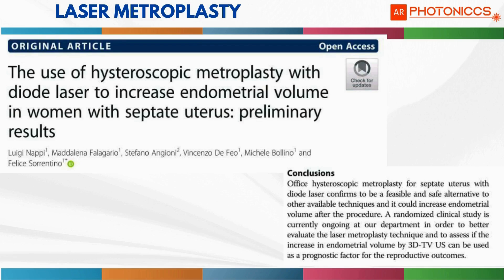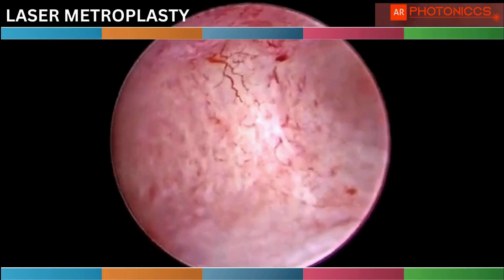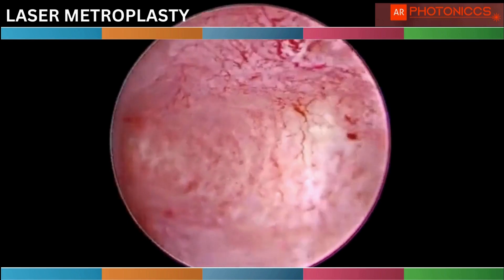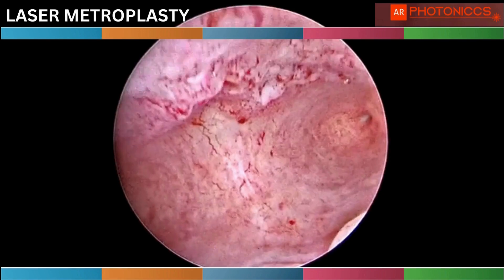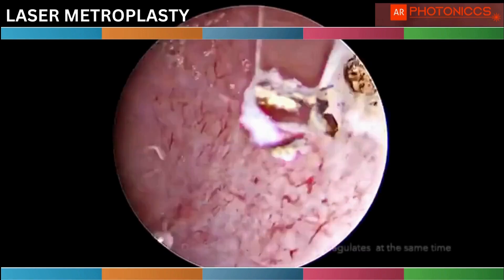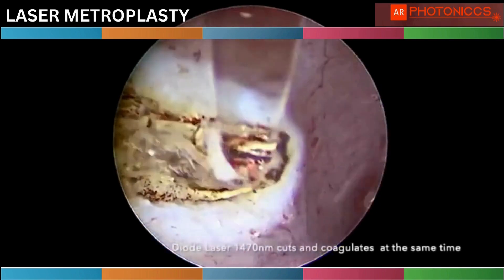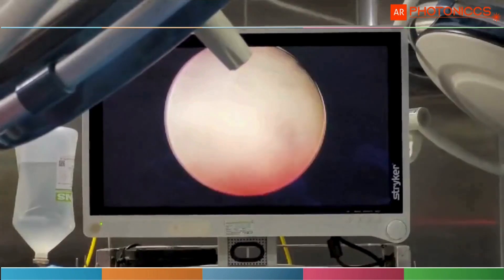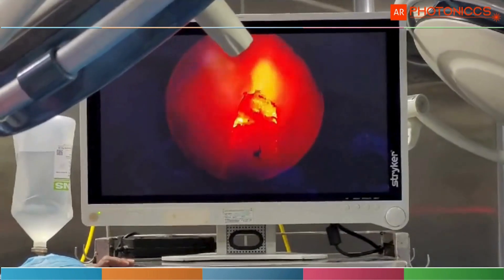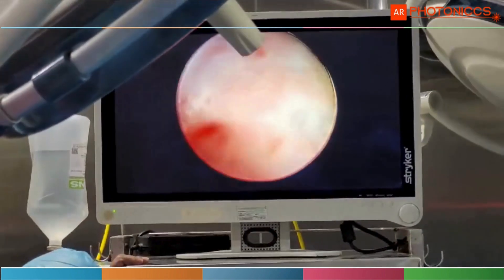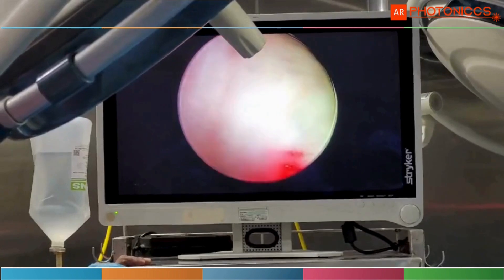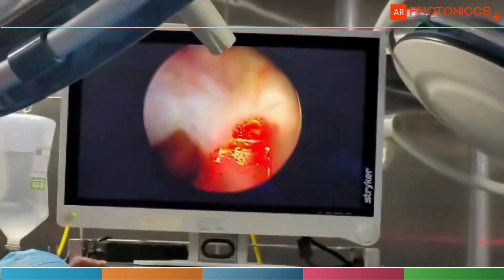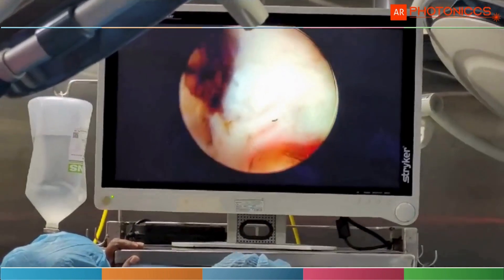Now it is detached. The next case is a sub-septum or septum — we can see laser metroplasty. We have many studies and articles and presentations using laser. The volume of endometrium is preserved, so for infertility this has the best efficacy. It is practical because the penetration depth is only 1 mm, and the heat spreading is only 1 mm, so the endometrial damage is very minimal compared to other energy sources. When you are doing metroplasty on a hypervascular septum, you can manage cutting and coagulation intermittently and simultaneously.